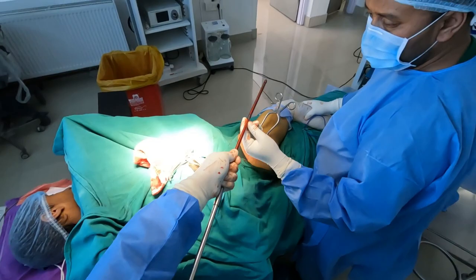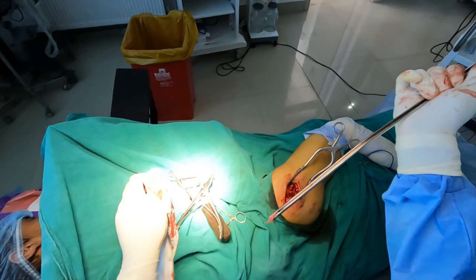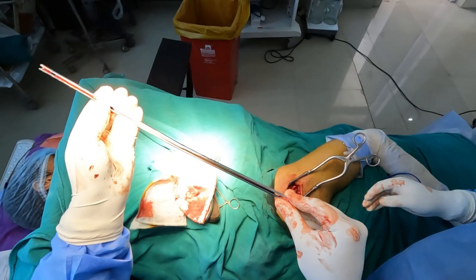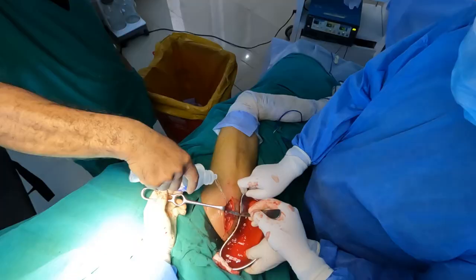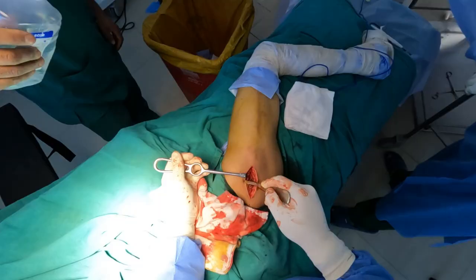The K nail has smoothly come out. After that I will be detaching it from the hook and inspecting the K nail to confirm it has not broken. You can see this is the proximal eye of the K nail with an anterolateral slot, and this is the eye on the lower side. The wound was thoroughly washed with normal saline and closed back in layers. This was the extracted K nail and the instrument used to remove it from the femur.